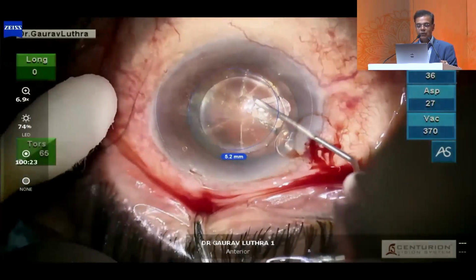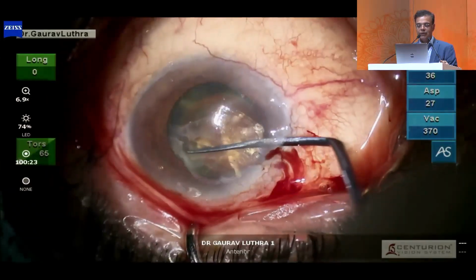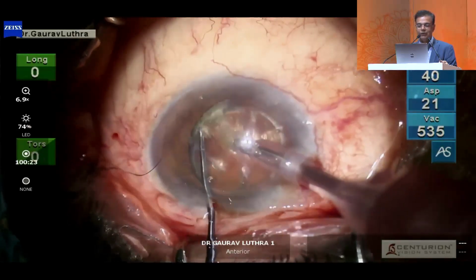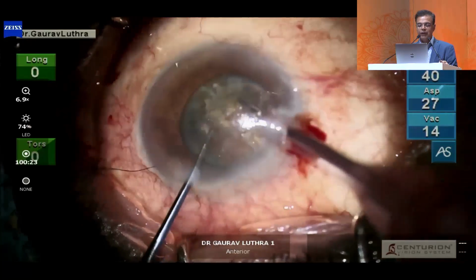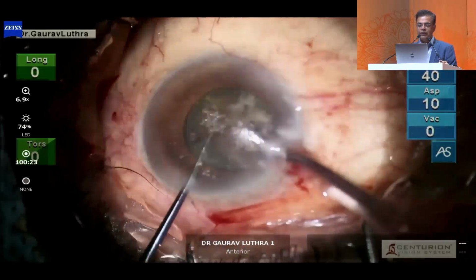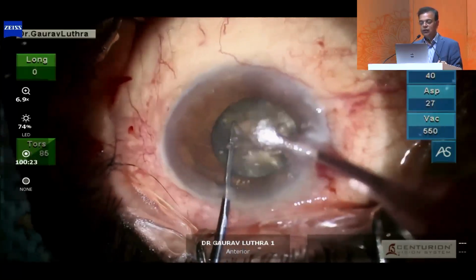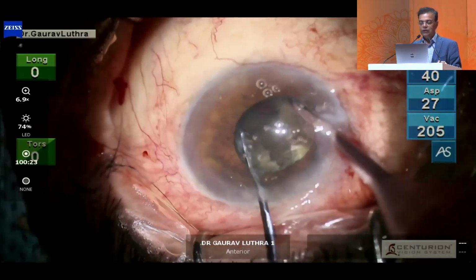I like to do a 6-quadrant crack. You can see that it's a really, really hard cataract. And then, because of the cavitation bubbles, usually it is possible to rotate these nuclei, but one should not use extreme force because there's very little cortical cushion. And these cleavage planes will usually form nicely in these hard cataracts because these are not opaque. So femto energy, unlike intumescent and mature cataracts where the laser energy won't penetrate more than maybe 50 or 100 microns, in these hard brown black cataracts, the laser energy actually penetrates quite well because they are still optically allowing the laser energy to pass through them.